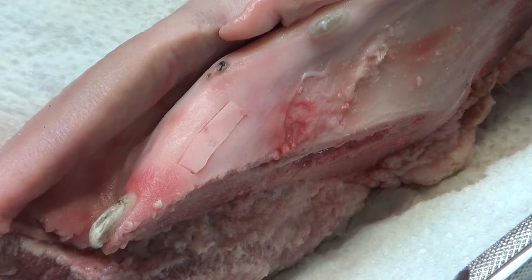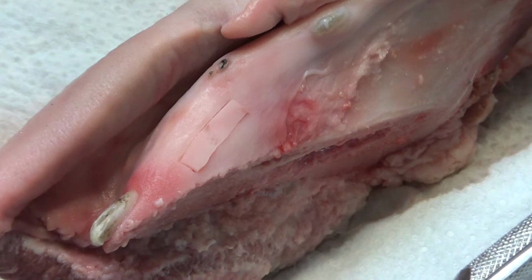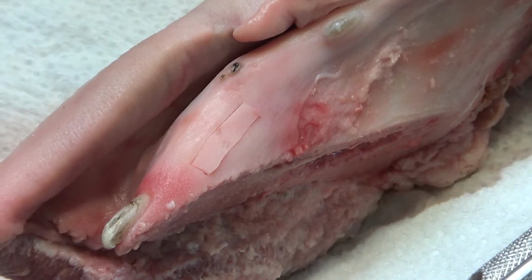Okay, so I can use the forceps to restart distally, go out of my depth and go mesially. At the end I finish and I do the fourth incision. Because in the mouth, at the beginning, you don't see exactly what you are doing with the first incision. So go, I don't know, 2 millimeters, okay? Then take the forceps, a little bit elevate, and then you can go deeply until the end of the depth you need. And then you remove it.